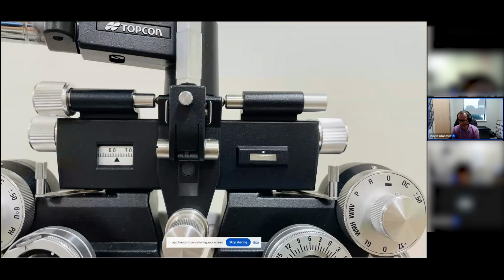You can see on the bottom right part of the picture, there's a knob. There's actually two knobs there. It has a bunch of letters on it. Right now, it has the O at the top with the little black line underneath it. That is used to set different modes for the phoropter. The most important ones that we're going to be using today are the O with a little line under it, which means that it's open and the patient can see out of that ocular, or OC, which is occlude. Occlude means that it's covered; the patient can't see out of the ocular.